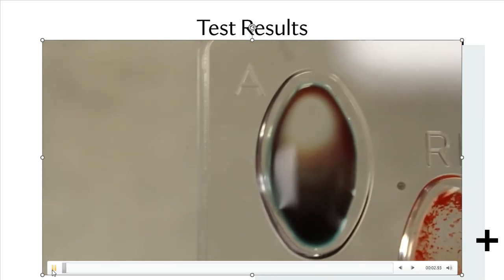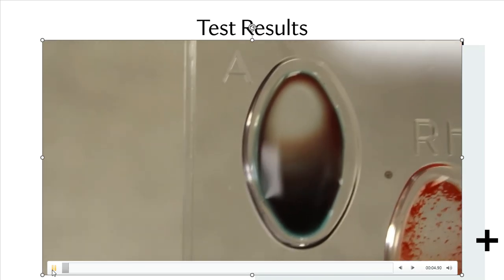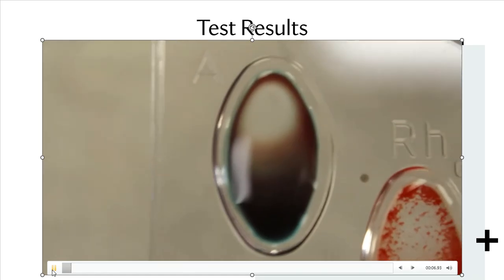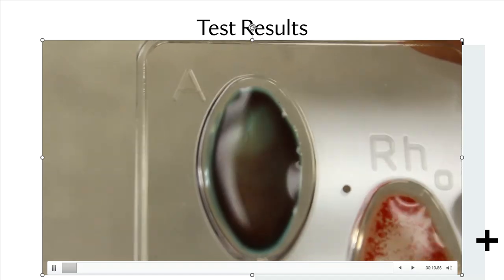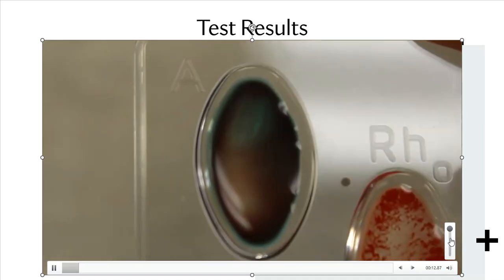All right, guys, this lab is almost finished. I promised you it was going to be short and sweet. It just needed a little sacrifice from your fingers. So here's a close-up of my well A. I've let this sit just for a couple of minutes.